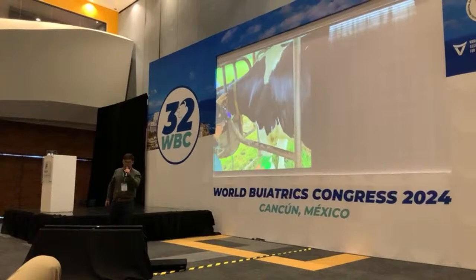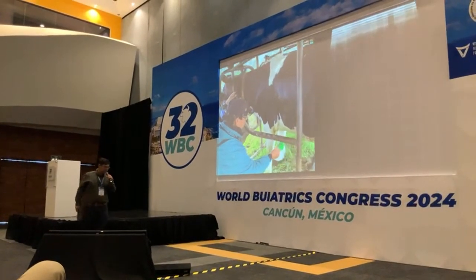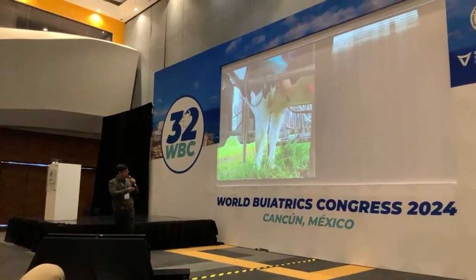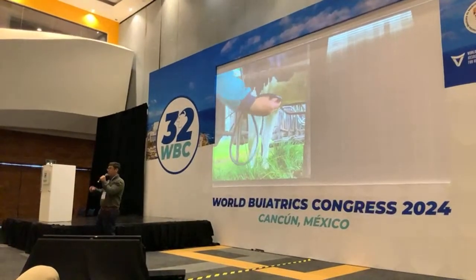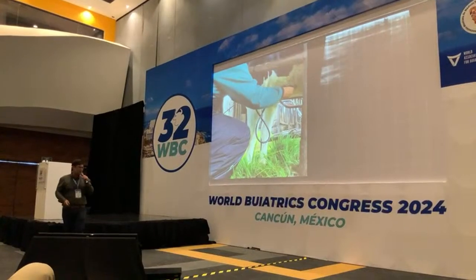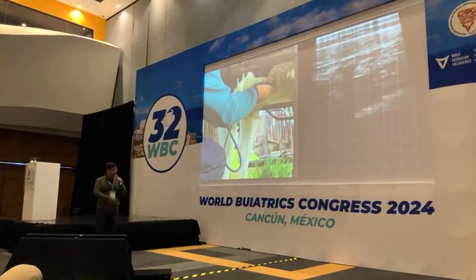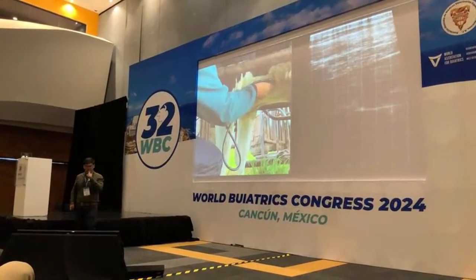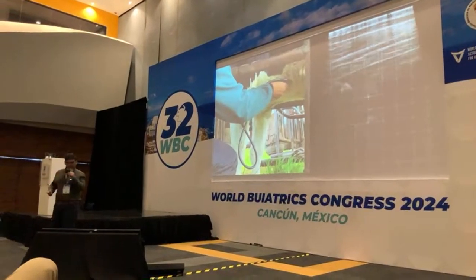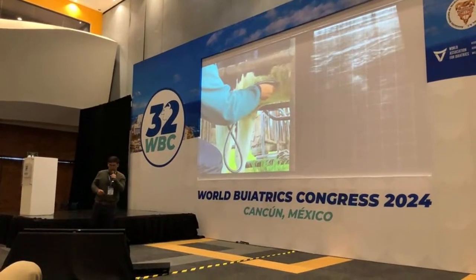So this is the place where you have to put the probe. One recommendation: there are a lot of cows who are very nervous when you touch them right there. The recommendation is, because you don't want to startle them, set the sprayer in the stream mode, and apply some alcohol just to warm the cow. The other recommendation is to put the tip of the probe facing internally. You will always see the reticulum, which should be pointing in the same place.